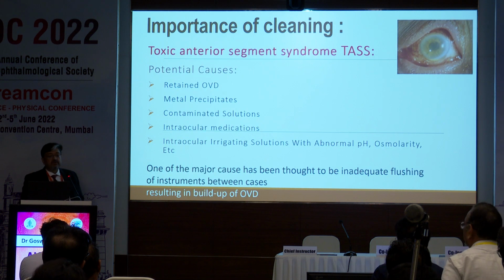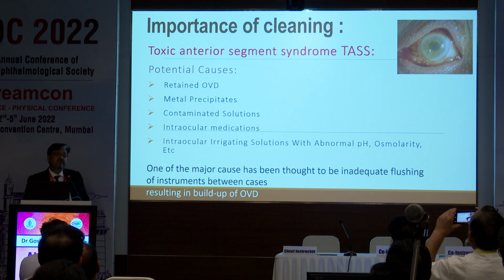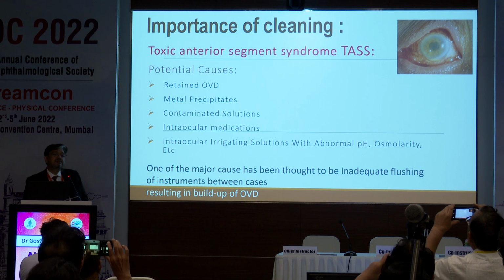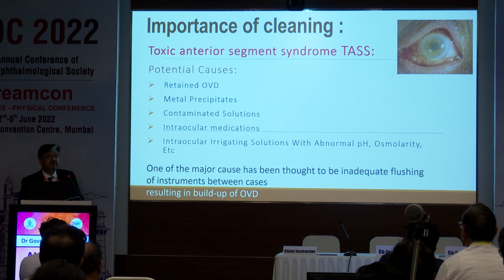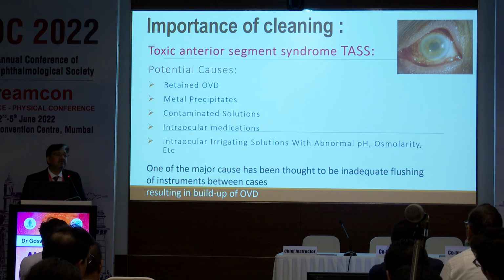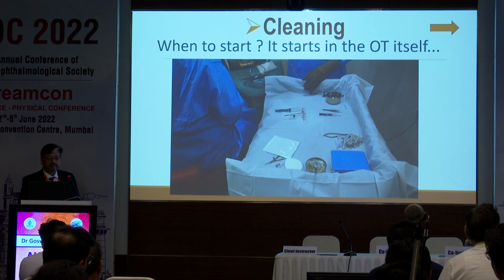So, of course, we know all of this, toxic anterior segment syndrome. I hope many of us haven't faced it. And the most common cause for this is, of course, OVD which has been left behind in the lumen. Of course, it can also be caused by metal precipitates, contaminated solutions, intraocular medications, and even intraocular medication or solutions which are not in the right pH or in the right concentration. So this is one of the major reasons why cleaning of instruments is essential.